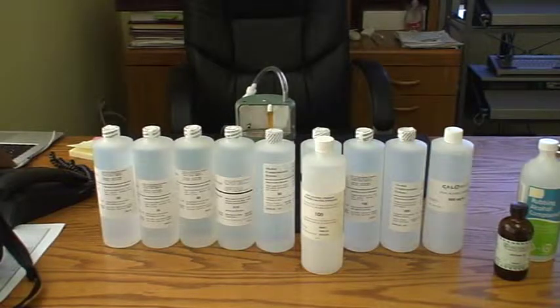When brought up to a temperature of 34.0 degrees Celsius, then the headspace in the top of the simulator, if it's pumped through the approved instrument, then it should give a reading on the breath instrument, in my particular case an Intoxilyzer 5000, it should give a reading close to the target value. So if I use 20 solution and I bring the temperature of the simulator up to exactly 34.0 degrees Celsius plus or minus 0.2 degrees Celsius, then I should be able to get a result on the Intoxilyzer close to the target value. And on every one of these bottles, the temperature is very, very clearly marked.